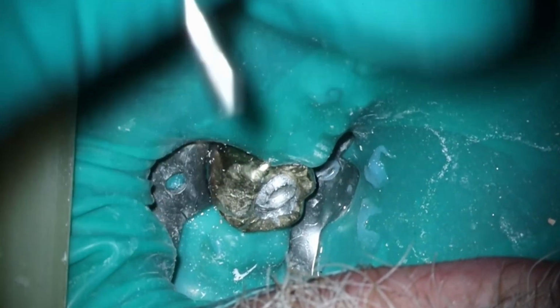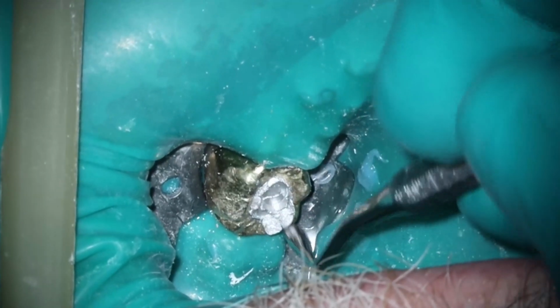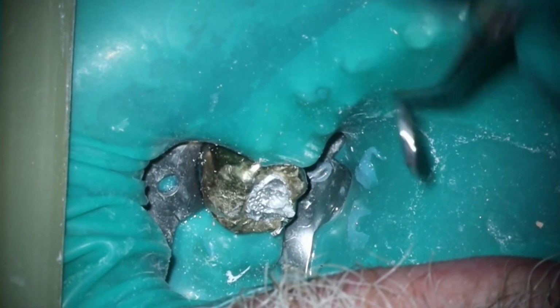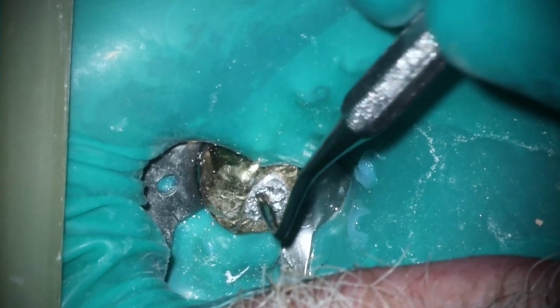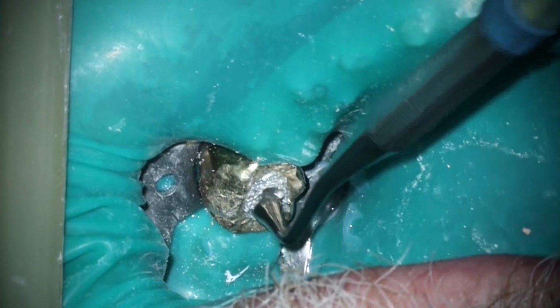And that's the cool part, is the flexible end is the same size as my normal thick end, which is what I use to sear off the gutta percha. So if I need to go into the canals itself, it still fits, even though it's a much larger size. If that doesn't make sense, let me know. I can make a quick short video on what I was talking about there. But if you haven't used that before, if you're having trouble with amalgams on access where it's really deep, let me know.